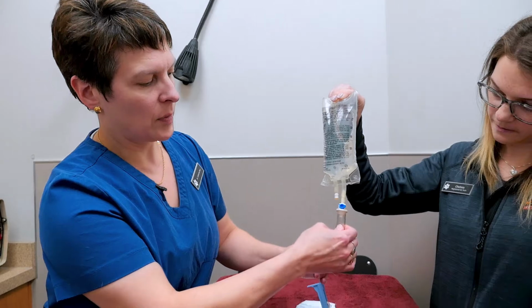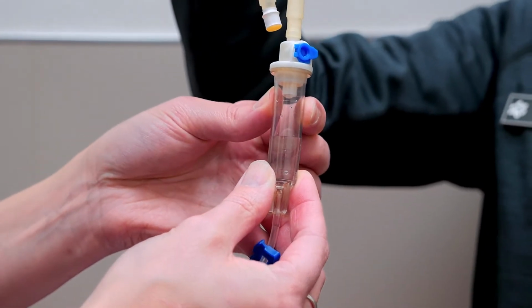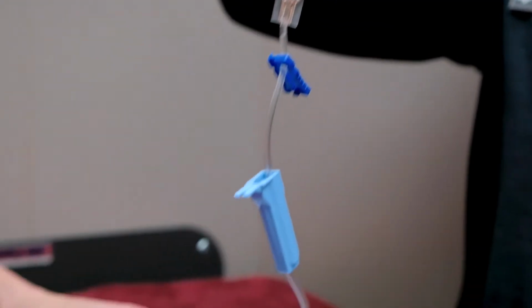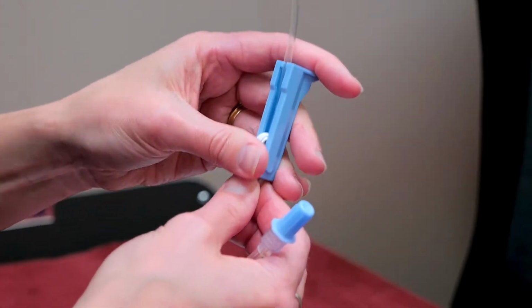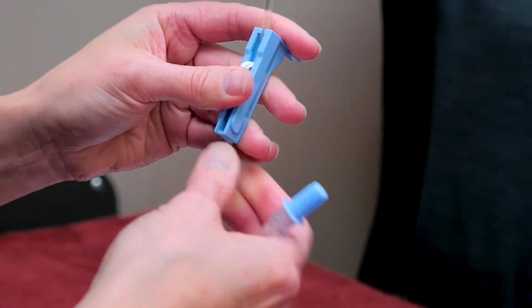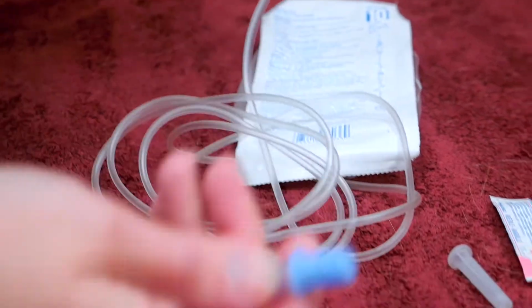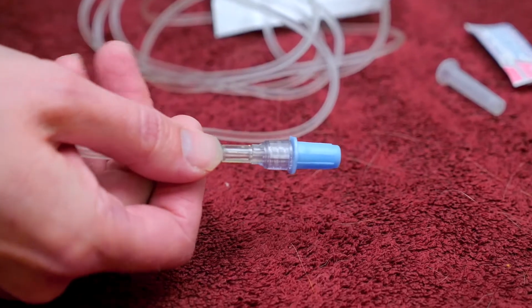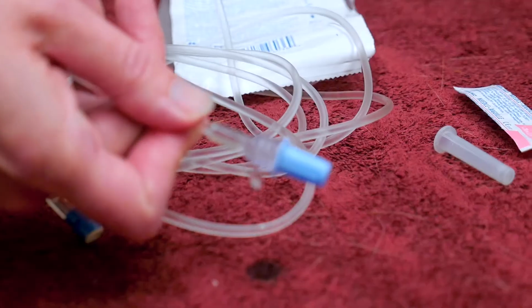You give this a little bit of a squeeze so that you get this half filled in the center part here, and you'll actually be able to see drops coming down about where my thumb is once you actually turn this on. The next step is to open up the end of flow here. So you're going to reopen this, but you're going to be prepared for the fluid to come down and out the other end. And you can actually see as I open that, fluid starting to come down at the top, and eventually all the bubbles are going to come through and liquid will start to come out the end here. And that'll probably show up on the towel there as that starts to drip.